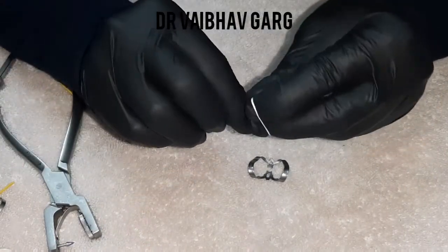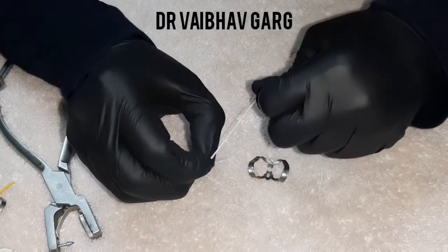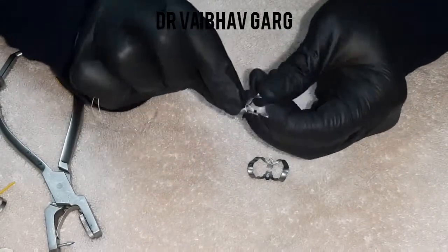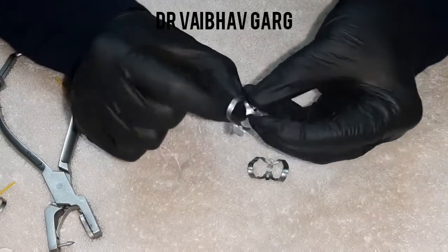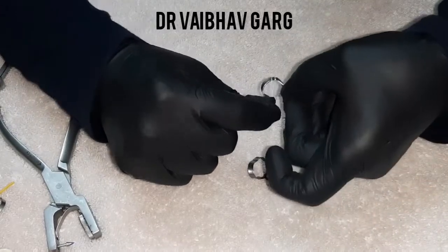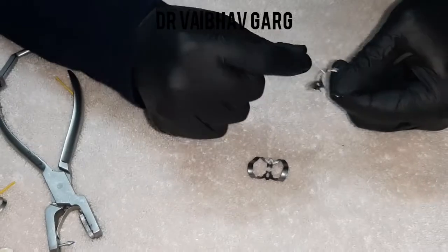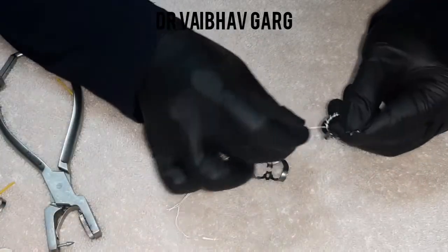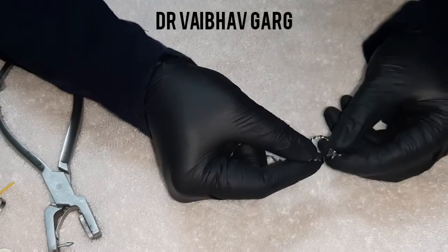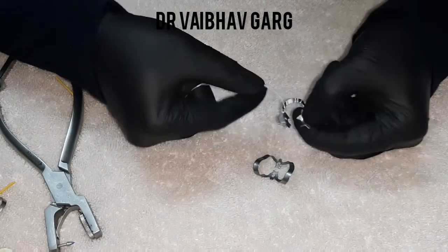This is the technique I have been using for a very long time — that's why it is in my hands. You can develop your own technique for flossing the clamp. You can see I am tying the entire clamp because if it fractures, it will fracture at the weakest point — the ring. In case a clamp fractures, it will fracture from the middle part of the ring. I have tied both sides, in the face and the back, keeping the loose end on the outside.